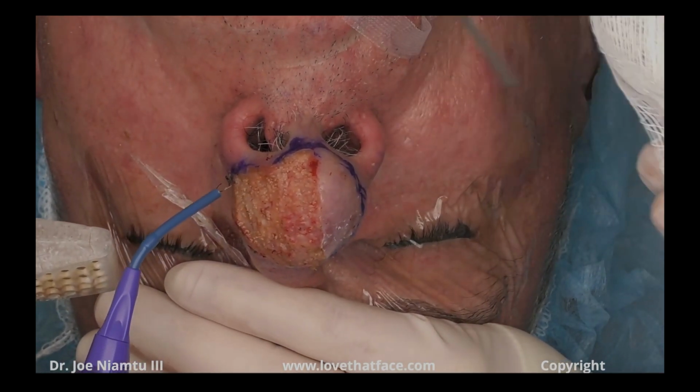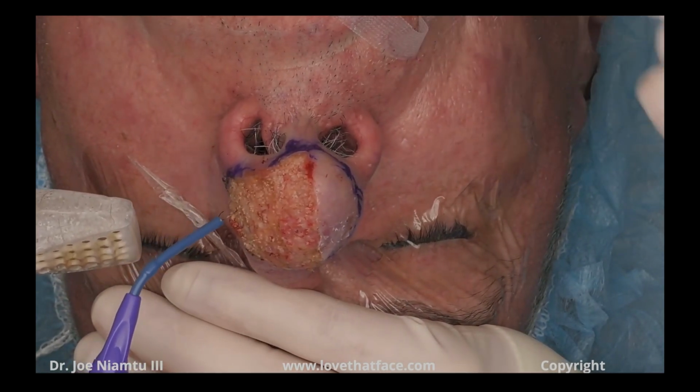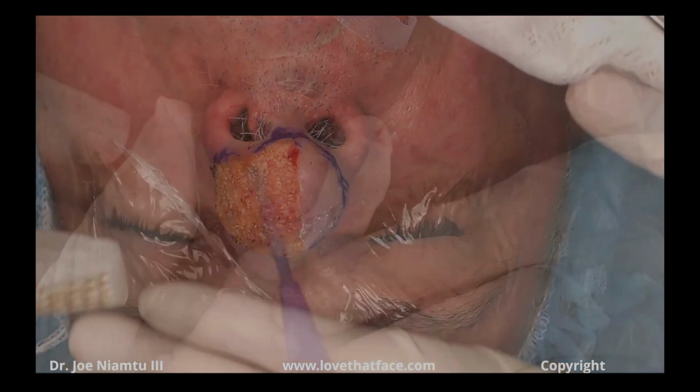So you can see that when the Soniquence is set at the correct settings, there is little, if any, bleeding. And I'm simply beginning on one side and shaving this down.